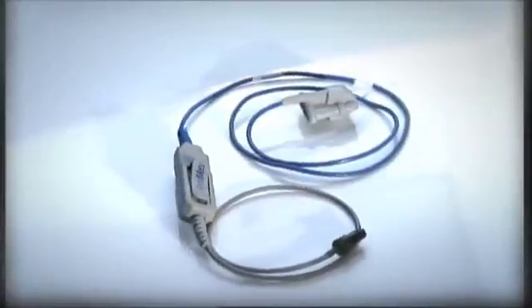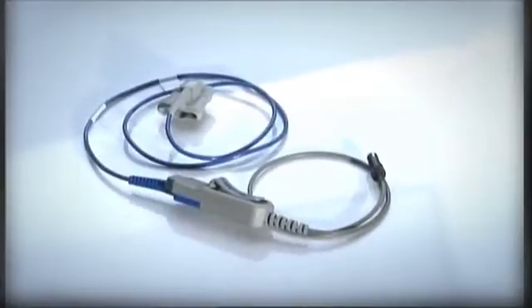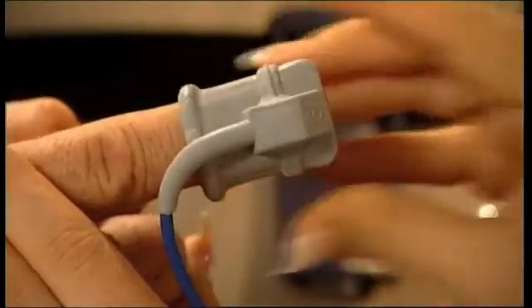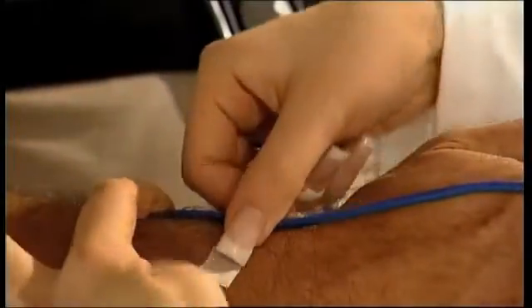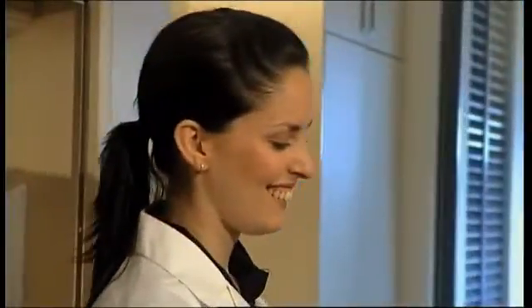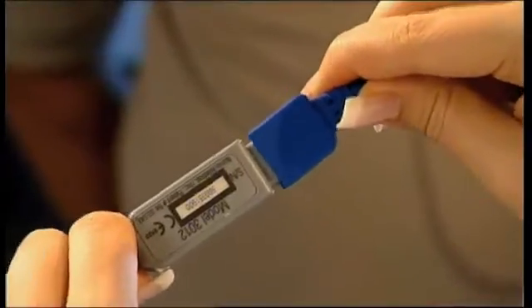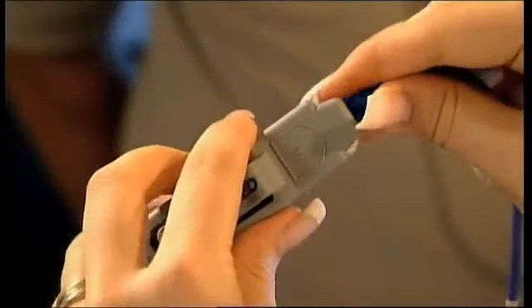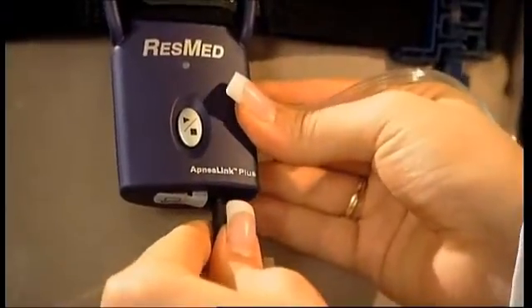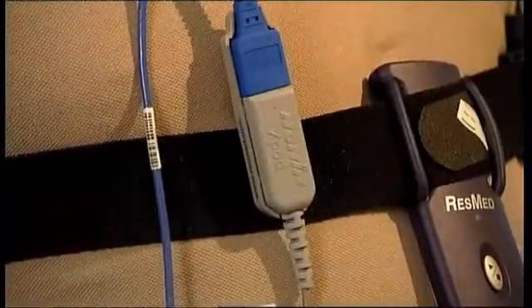The one remaining task is to attach the pulse oximeter. For ease of use and economy, ResMed recommends using the Noan Soft Sensor. Place the soft sensor on your patient's index finger and secure the line using the soft tape supplied. If you'd rather use another oximetry component, please provide patients with those instructions instead. Connect the cable to the pulse oximeter and insert this connection into the clip-on holder. Connect the other end to the recorder.